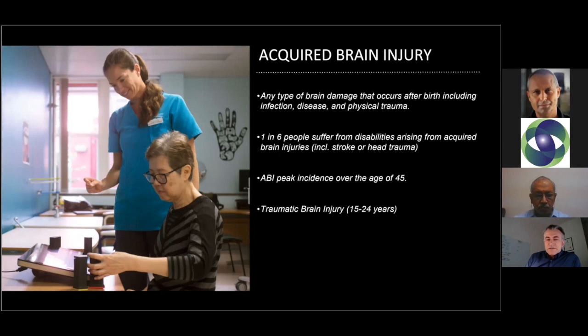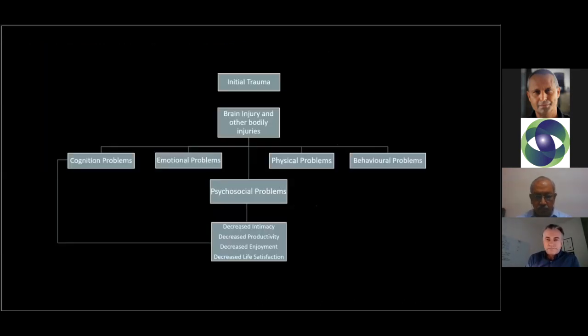The effects of brain injury often have broad impacts on both motor and cognitive systems. The optimal treatment window is usually the first 6 months post-injury. As I mentioned, physical therapy works, but it's repetitive and very labor intensive.